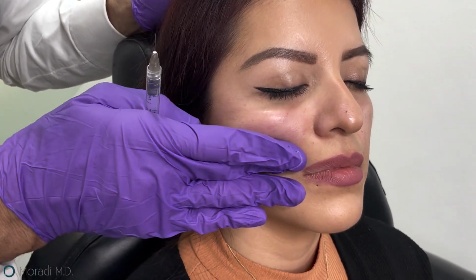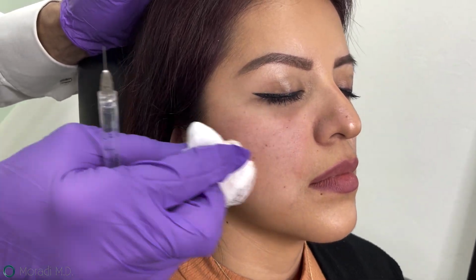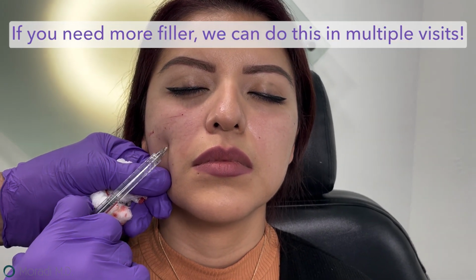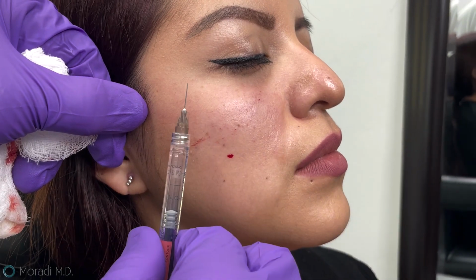Our goal is to make the transition smoother. We're not trying to make the face look puffy or swollen. Many times, we can do this in 2 sessions. If somebody needs a lot of filler, it's best to bring it back in a few weeks and inject some more again. So what's important is to see how this transitions from one side, one dimension to the other.